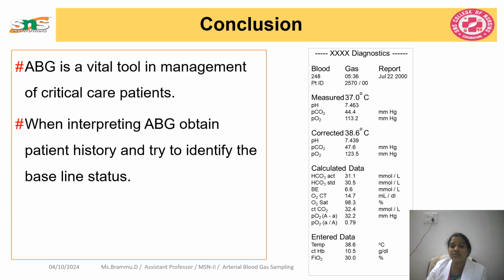So this shows a pretty good value where the patient is now stabilized in spite of a good O2 inflow. This is how we have to correlate with the patient condition and come to conclusions whether it is compensated or whether the patient has acidosis or alkalosis, and we will also go in depth whether it is due to renal or respiratory causes.